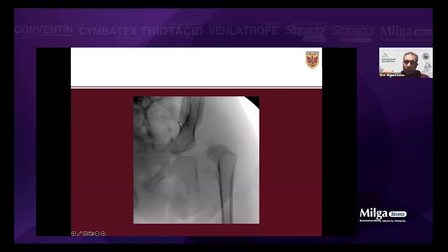For my next step, I usually move up. So once I found the interval, I take a deep breath and then I go to the iliac crest. At the iliac crest, there will be the abdominis obliquus muscle covering, overlapping the crest, and it's very close to the abductor muscle. So I will open the fascia with a Bovie, and then I will peel off the muscle, not completely from the iliac crest, the abdominis obliquus, but about three quarters of it from lateral to medial, making sure I repair this at the end. So, peeling off the muscle to expose the iliac crest.